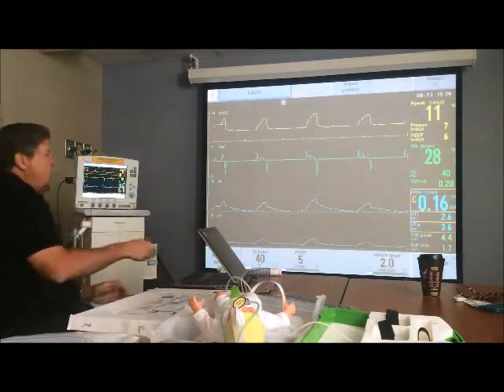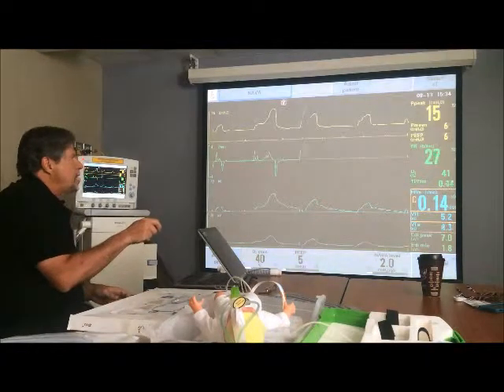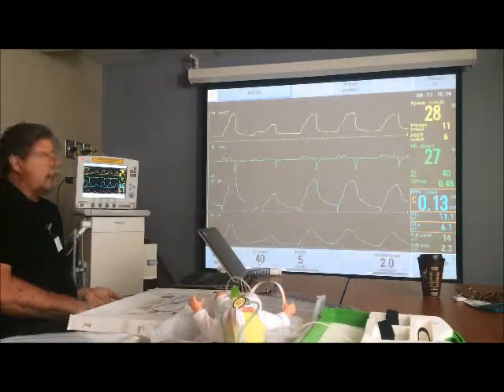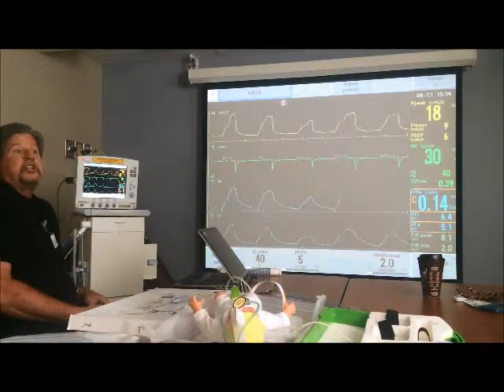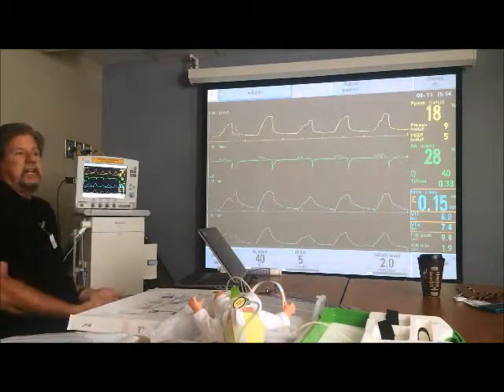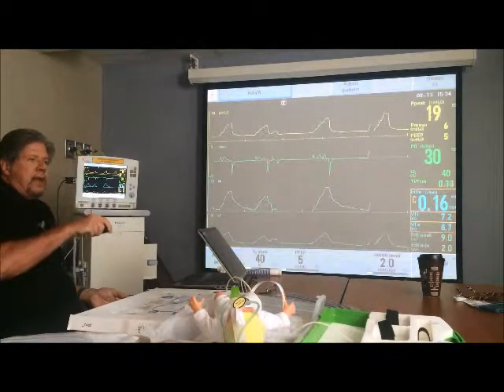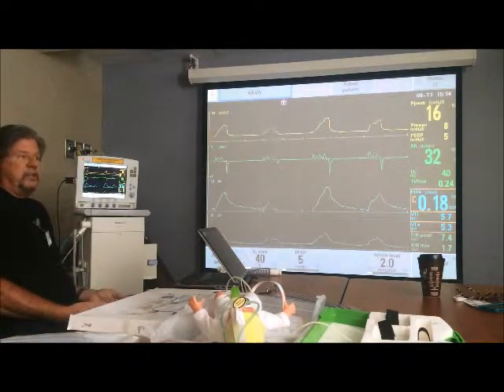Okay? Now another way that you can do it, rather than doing the math this way, just say peak pressure 15 minus PEEP of 5 is 10, so on that breath he got the equivalent of 10 centimeters of pressure support. On this breath, 28 minus 6, he got an equivalent of 22 centimeters of support. On this breath, he got 20 minus 5 or 15 centimeters of support. That math, doing it this way, would work out to be exactly the same as working the math this way, in terms of how much pressure support the patient gets on each individual breath.